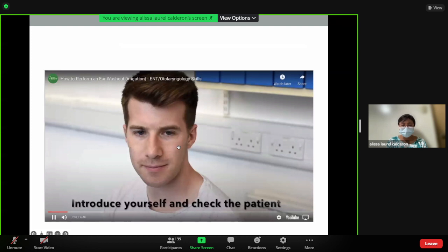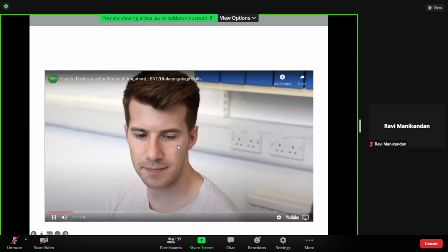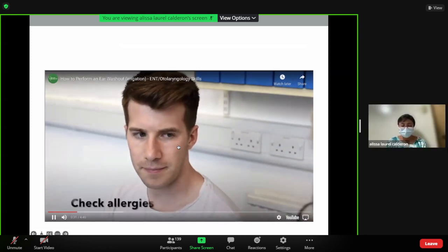Hi, my name is Misha. What's your name? James. Hi, James. I'd like to wash your ear out today. Is that all right? That's fine. Okay. First of all, I need to look inside your ear. Okay. Do you have any allergies? No.